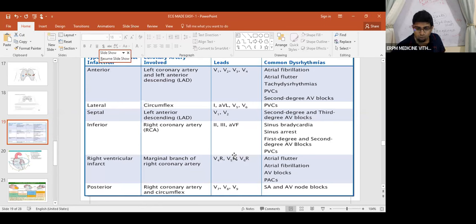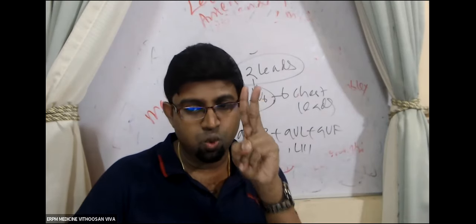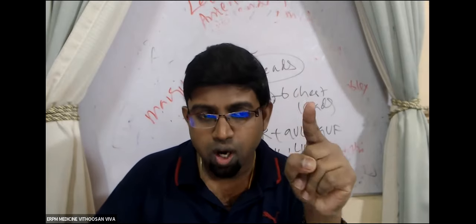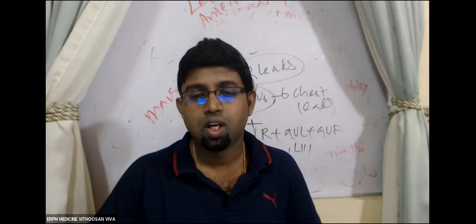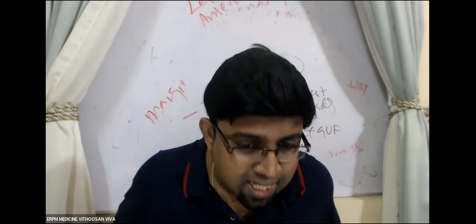Now look at me. I have discussed the 12 leads. These 12 leads are looking at the heart from different angles.